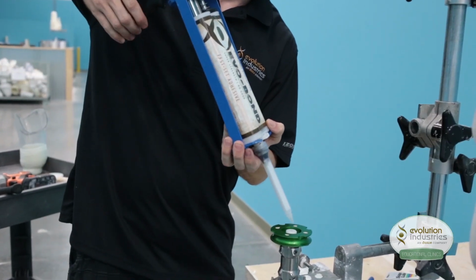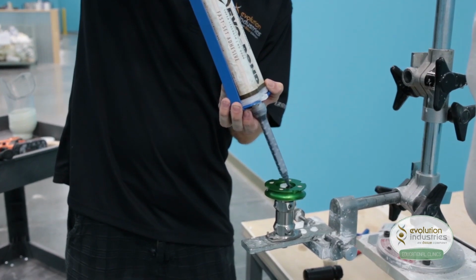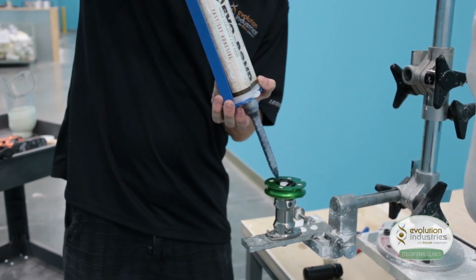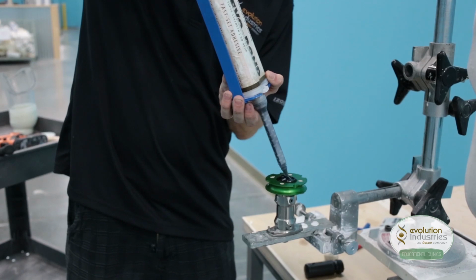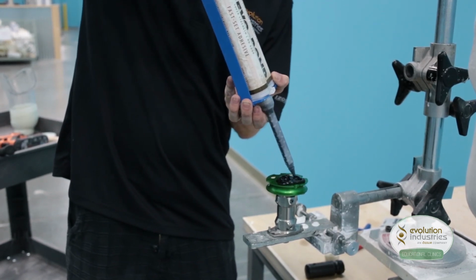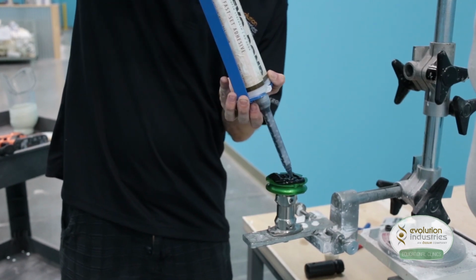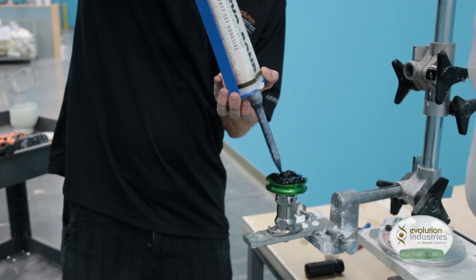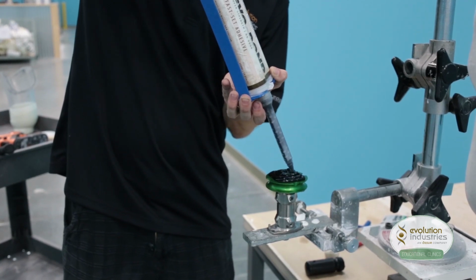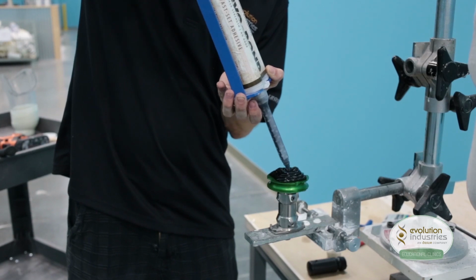So first we fill in around the housing. Make sure it gets into the threads good. Cover the housing, and then we cover all 4 screw holes, and that also blocks it from the resin during lamination. And create a nice level of Evo bond there.